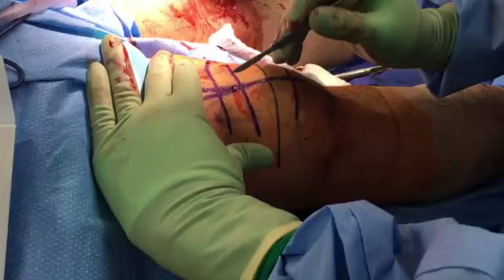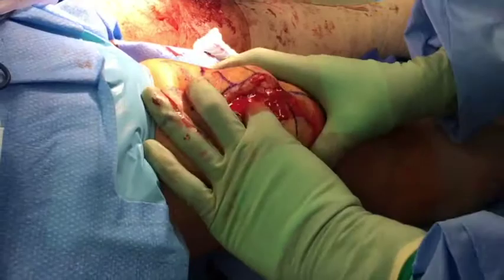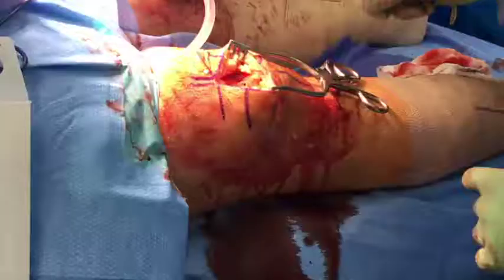The incision is centered just above the superior pole of the patella. Dissection is carried down to the tear site and the hematoma is encountered and evacuated. The joint space is then thoroughly irrigated at this time.